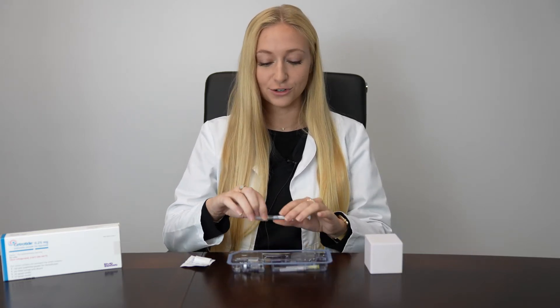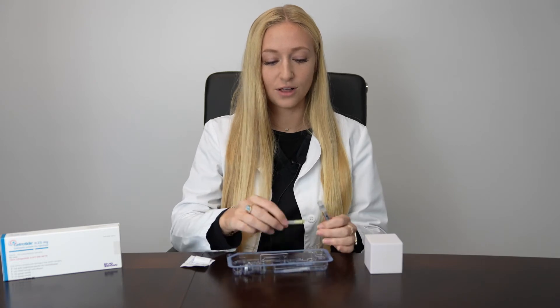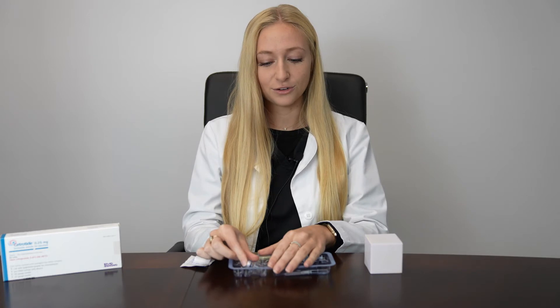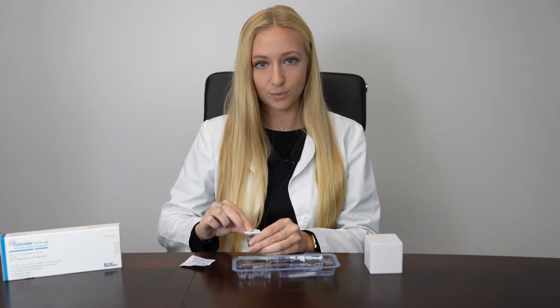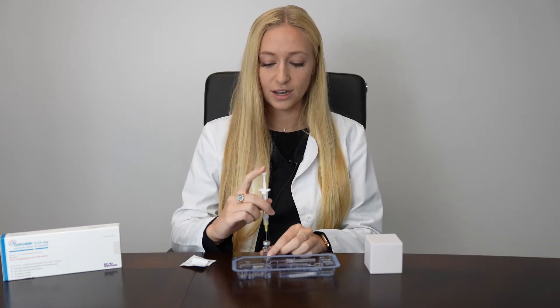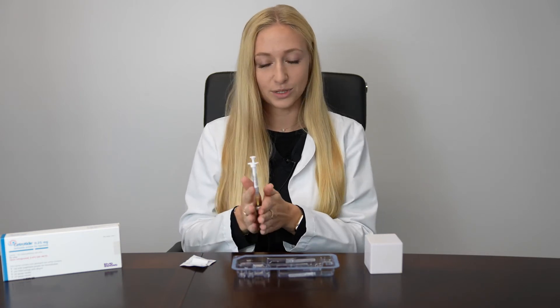After washing your hands, the first step is to attach your mixing needle onto your pre-filled syringe of liquid. You can then take your vial of powder, pop off the cap, and wipe the top with an alcohol swab. You can then inject your entire pre-filled syringe of liquid into your vial of powder. Gently mix the medication between your hands until all of the medication has dissolved within the liquid.